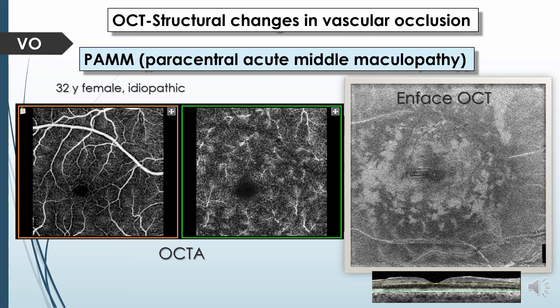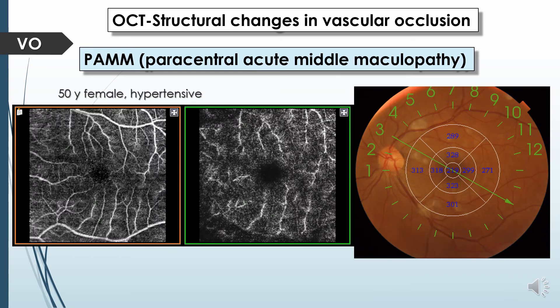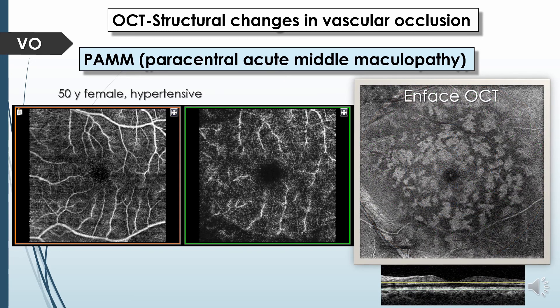In another case of PAM in a hypertensive female, OCT angiography shows loss of flow signals at the deep capillary plexus and loss of the characteristic pattern of this plexus. En-face OCT shows hyperreflectivity around the occluded venule with a characteristic fern-like appearance.